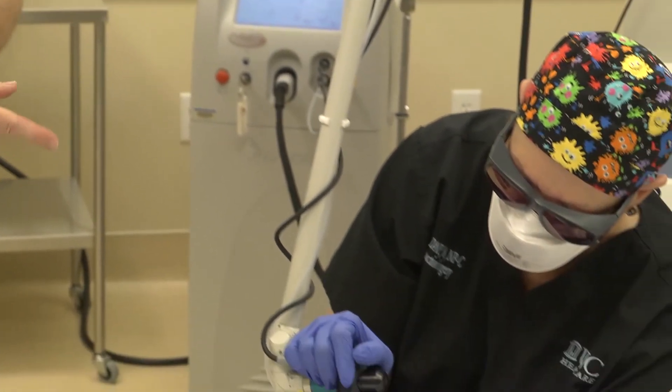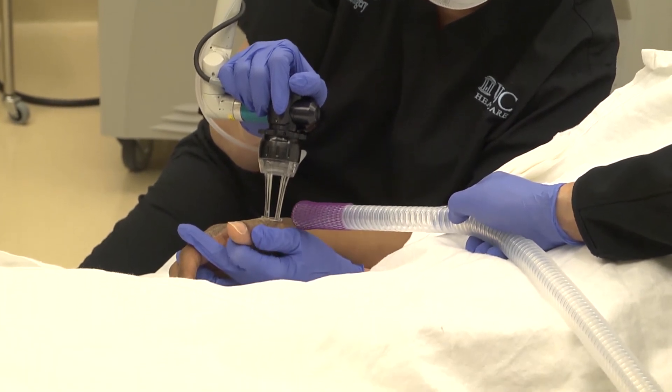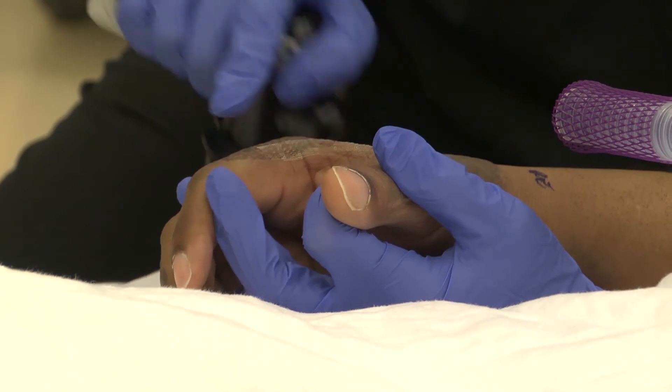We're focusing on these thick, tight scars on his hand. These often occur at the junction between the skin graft and the unburned skin.